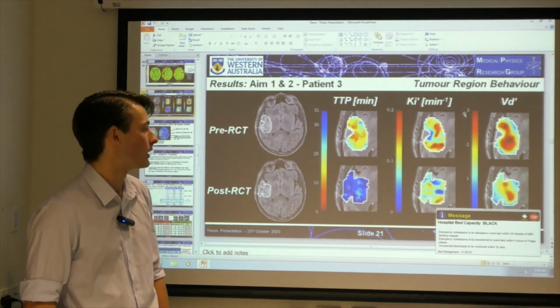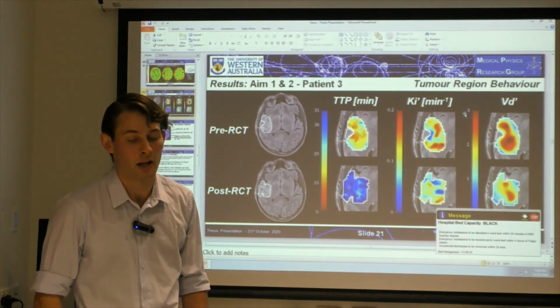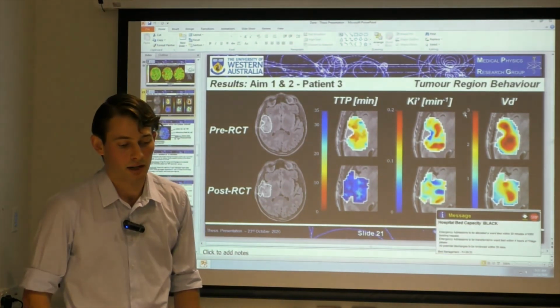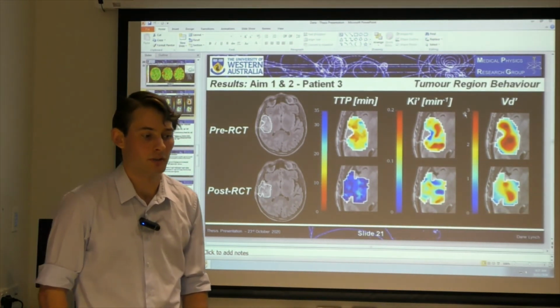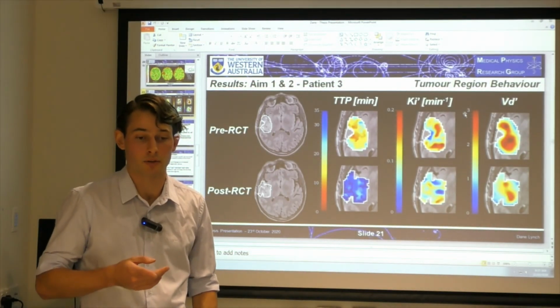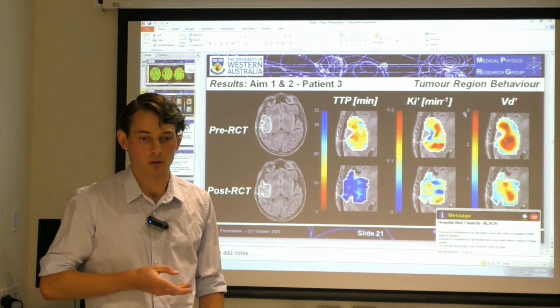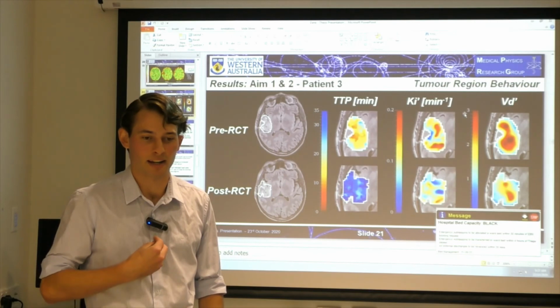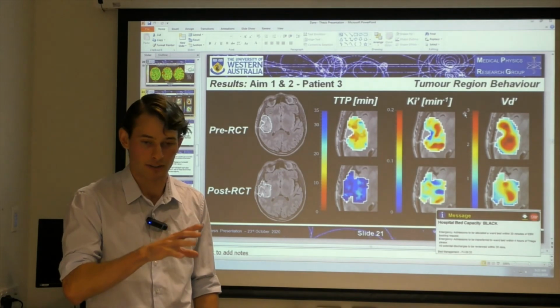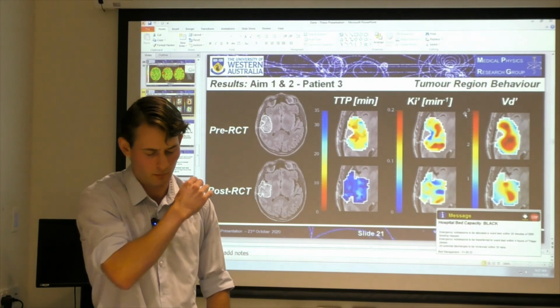Yeah, so it's a good question. The most labour intensive part is definitely contouring the sinus vessels of the dynamic PET scans, which I had to do manually for all 53 scans. And that, again, will introduce observer bias, but there might be adaptive ways to segment these sinus vessels, possibly using machine learning or more automated methods than just me sitting there and contouring exactly where they are. So while that's the most intensive part, I could definitely see ways that could be automated in the future. What was the second part of the question?